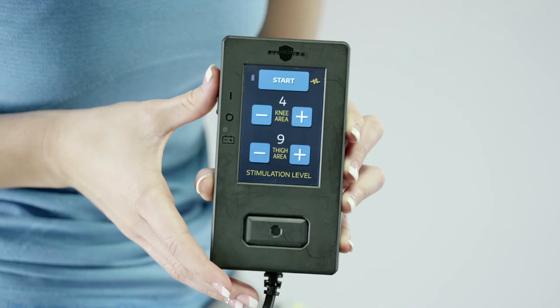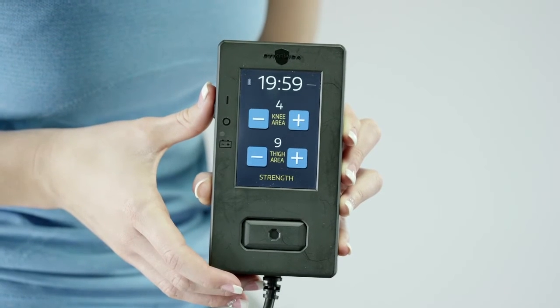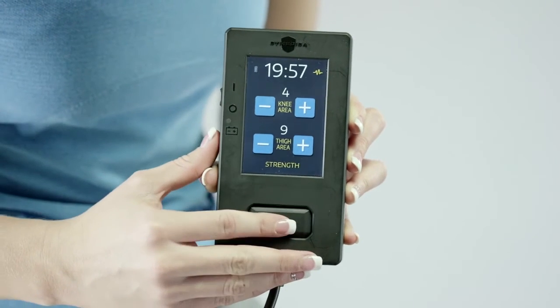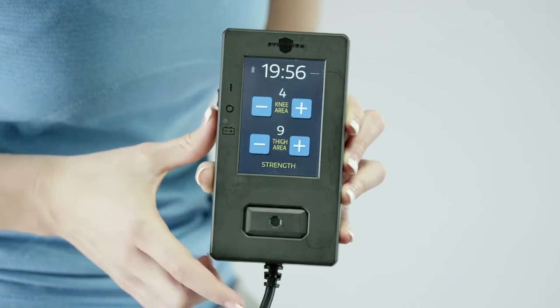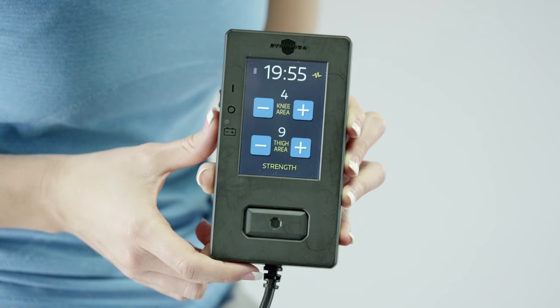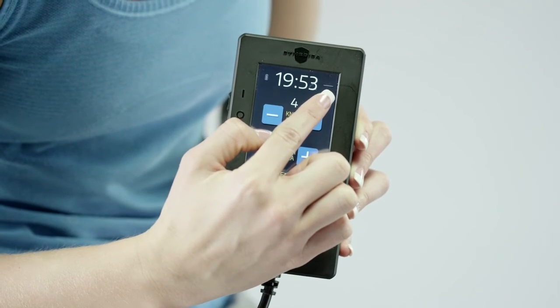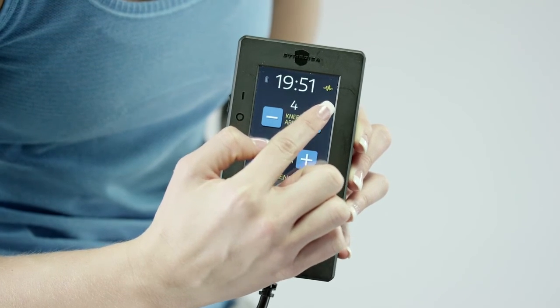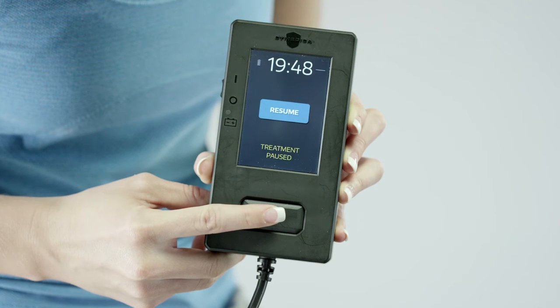Once the knee area and thigh area are set, select the start button to begin the treatment program and the 20 minute countdown timer will begin. You can press the hard pause button at the bottom of the user interface at any time to pause the treatment. Hit resume to resume the treatment. During treatment, the user interface will transition between periods of stimulation and periods of rest and will indicate when stimulation is active. The yellow symbol in the top right corner appears when energy is being delivered to the electrodes during the work period. The gray bar indicates that no energy is being delivered during the rest period.